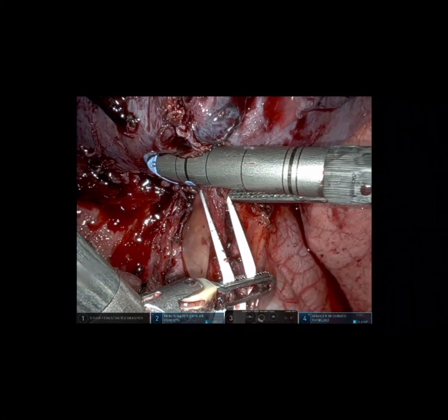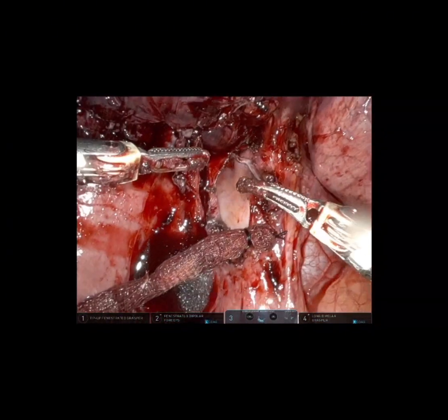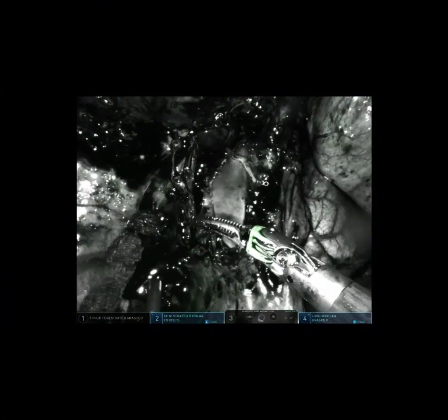And this video is just going to show you how to control the vessels. That's a blue load on the inferior pulmonary vein coming from robotic arm 4. Now the EGD going down the esophagus. And yeah, we're right on it all over his esophagus.